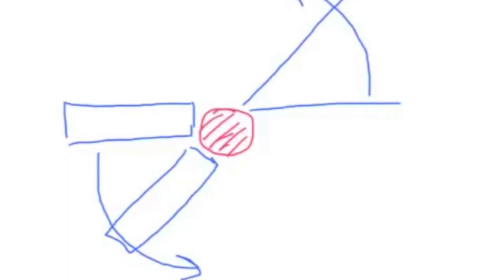So just to reiterate, if the needle is towards us, so the lesion's away from us, and we scan back and forth, we're going to rotate everything clockwise. When the needle's on the far side of the lesion, away from us, we're going to rotate counterclockwise.